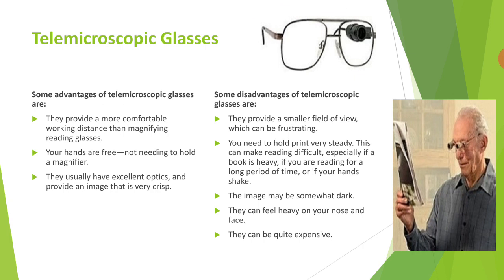The advantage of using telemicroscopic glasses is that they provide a more comfortable working distance than magnifying reading glasses or clip-on loops. Your hands are free, not needing to hold a magnifier. They usually have excellent optics and provide a very clear image.